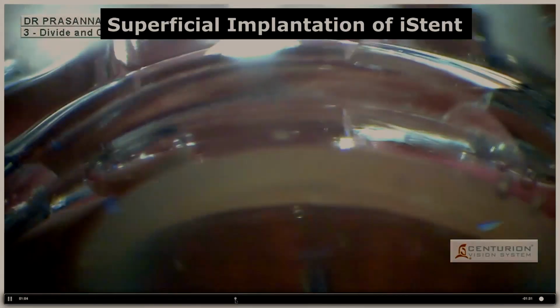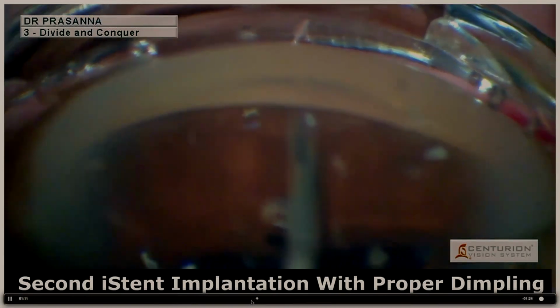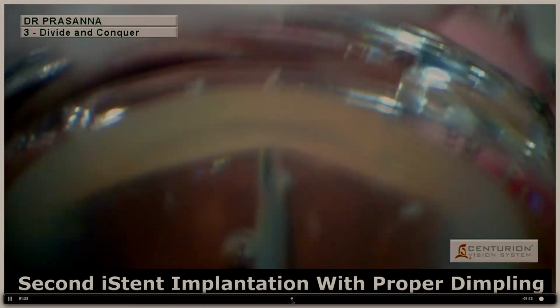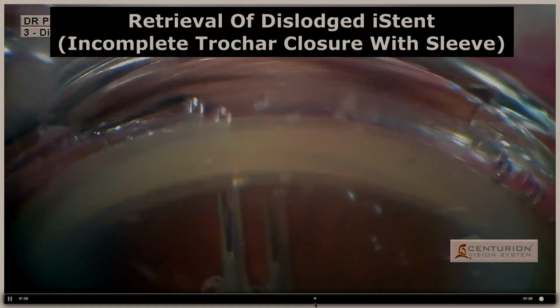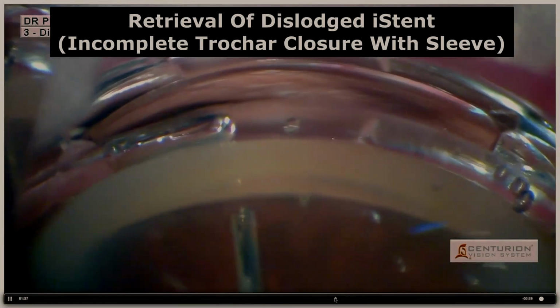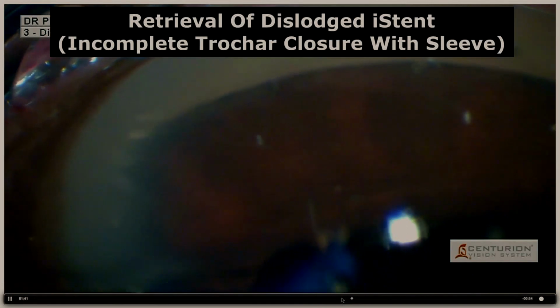And you tend to have a fair share of complications in this as well, where there was a superficial implant. You always have to reassess yourself, place the second stent first, then you'll have an opportunity to reassess, retrieve. And in the initial stages, there were not many videos, and you tend to be over anxious. I forgot to close the trocar. So these are some basics you need to keep in mind.